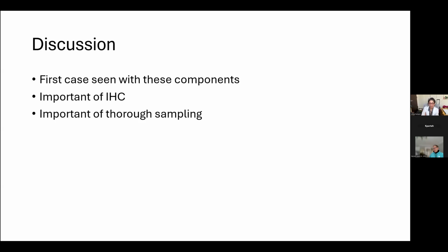And that was what made me say, no, then I need to go and actually take a lot of samples and see maybe there's something else that I'm missing. And that's what made me go up to the total amount of slides that I went to. And after looking at all of it, predominantly it was mainly the stratified squamous part that was there, except for some small foci that had thyroid tissue and the lymphoid aggregate.